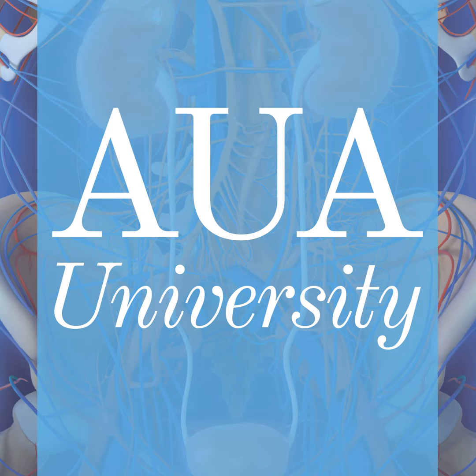What you also can see, and due to my age, I have to get my glasses, is when you look at the SUV values, which are shown down here, they usually do not exceed 3.0. You also can see that there is a different expression mode, but most of these patients with the celiac ganglia have some type of moderate PSMA expression.